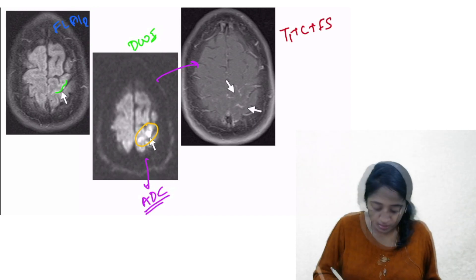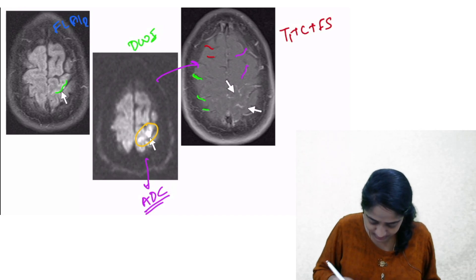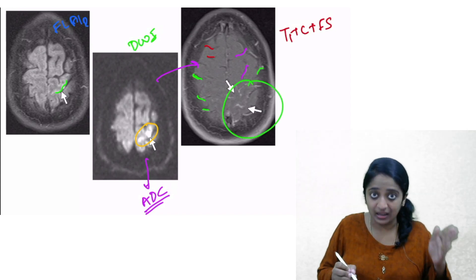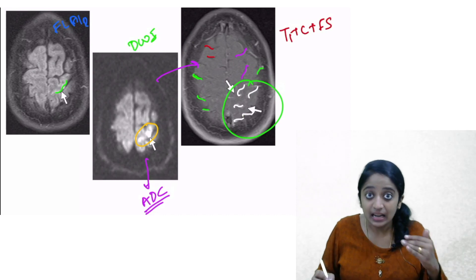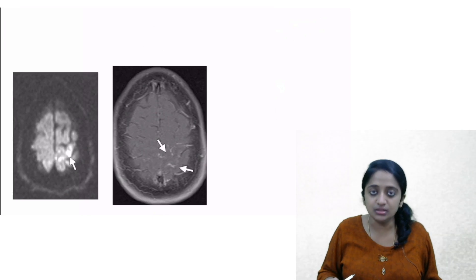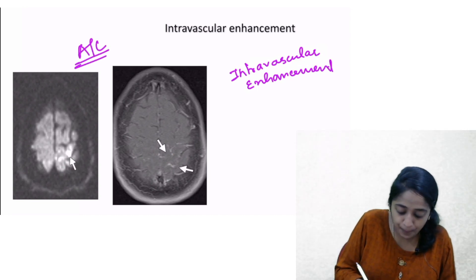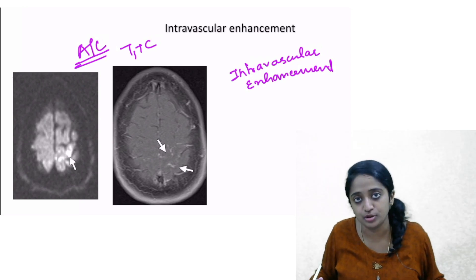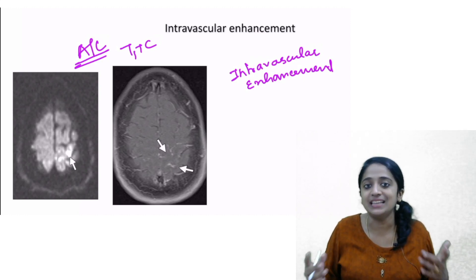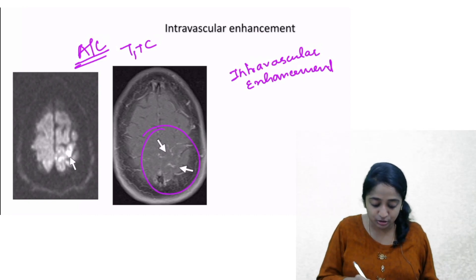Comparing right and left sides on the post-contrast T1 image, on the right side I see cortical sulci with a few vessels. On the left side, I also see cortical sulci, but compared to the right side, there is an increase in the number of vessels in the cortical sulci on the left. This stark contrast — left more prominent than right — is known as intravascular enhancement. This is an early sign you look for in acute infarct on post-contrast sequences. The cause is increased collateral vessel formation, as the body tries to re-establish perfusion after the acute vascular event by developing collateral vessels.